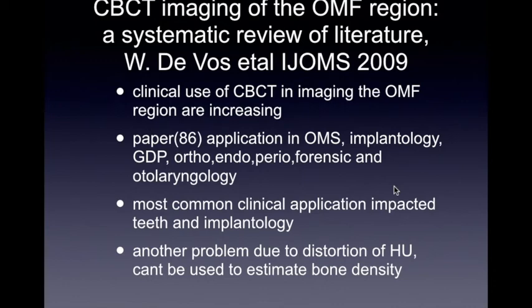No three-dimensional imaging modality outweighs the other because as one has its advantage, it also has an inherent disadvantage. You get a better, more predictable result with medical CT scan. That's why you get the ability to notice subtle changes between tissues, but it has more radiation. It takes longer.